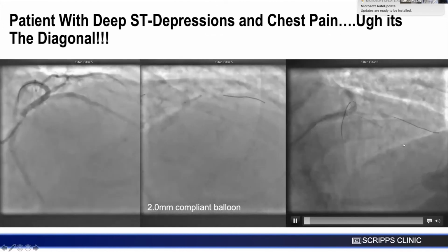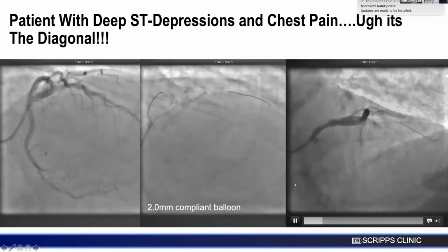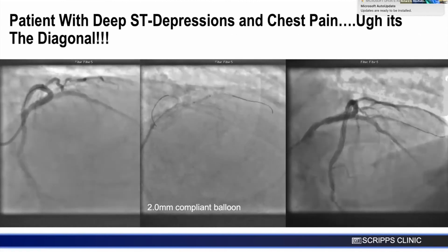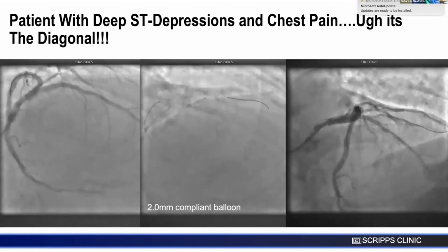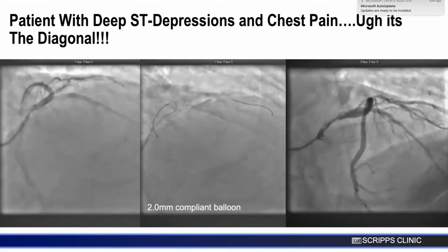This is always a classic sign of a patient in chest pain, right? The hand is now creeping up into the fluoro. But we have flow now, right? Say that again? He's just directing you to where to wire. Exactly right. You wired through the stent struts, right? Dilated that. Yes, I did.